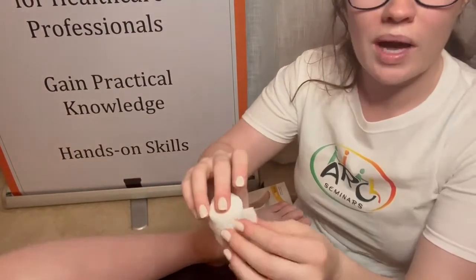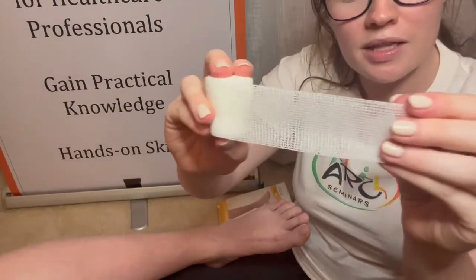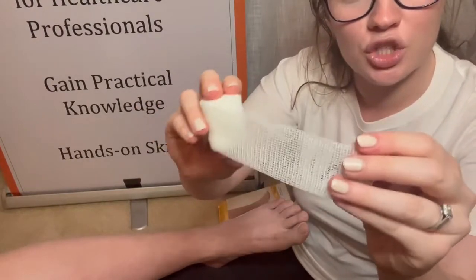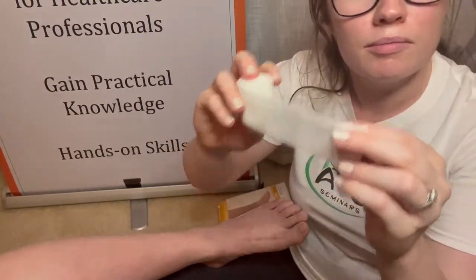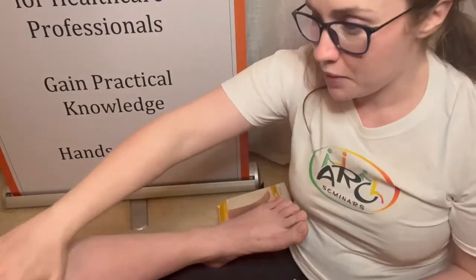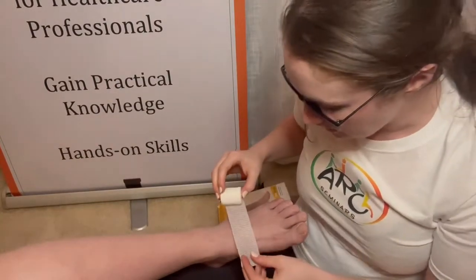So make sure that you have your gauze. I'm using 4 centimeter Molalast here. This gauze is woven, so it gives a really nice compression without being too irritating on the person's foot. Of course, we've done our skincare and we have our liner on at this stage, but I want to show you without the liner so you can really see the technique.